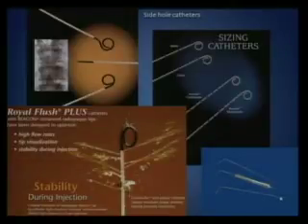So you're making a hole outside of the patient? Yeah. You make a hole on the table, outside the patient. You add an extra hole. You need to aspirate something, or you need to add some holes. So this is a punch device to make extra holes.